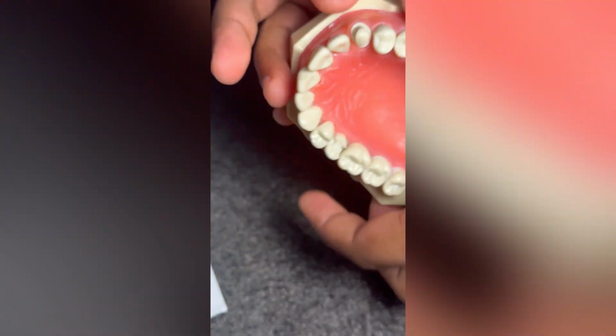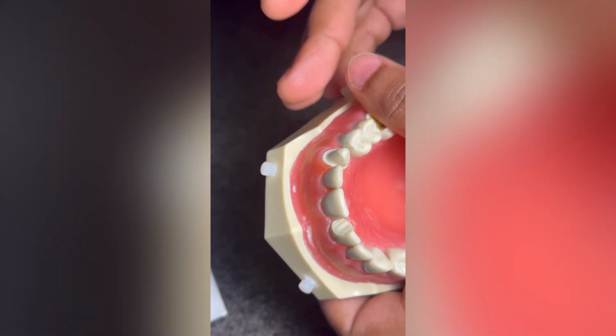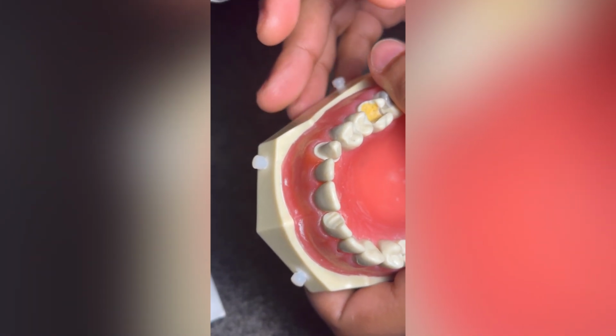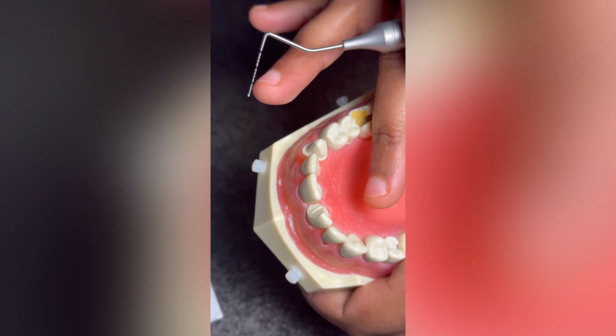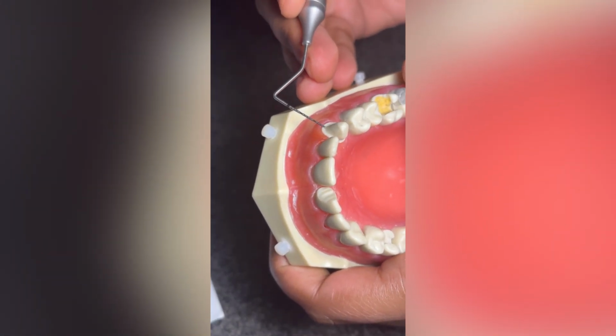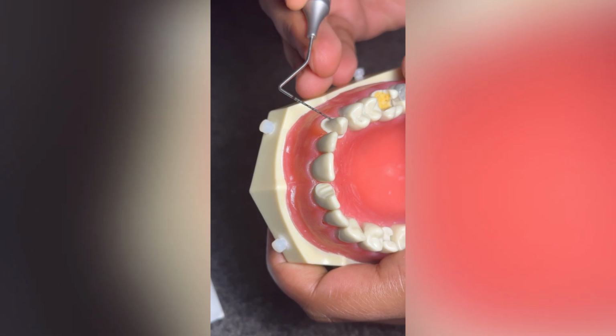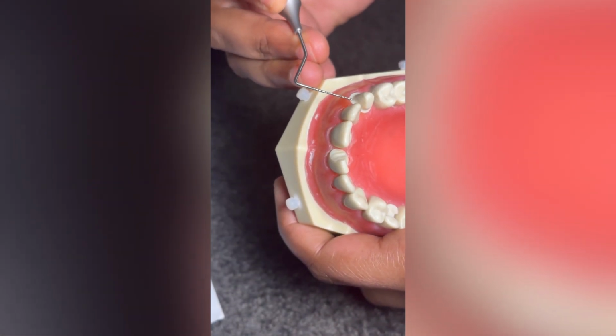Now with the margin width, let's have a look. We are aiming somewhere between 1.2 to 1.5, so you can fall on the satisfactory buccally, and definitely less than 1 millimeter palatally. Yes, that is just a bit more than 1 millimeter.